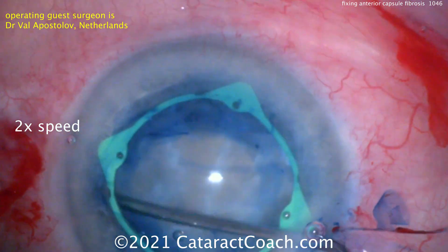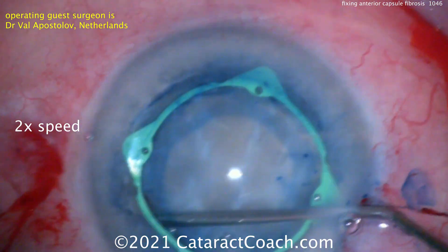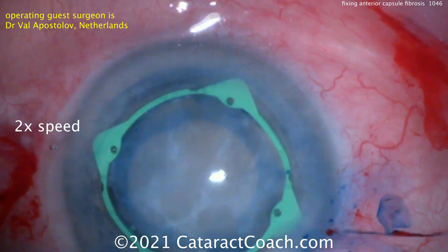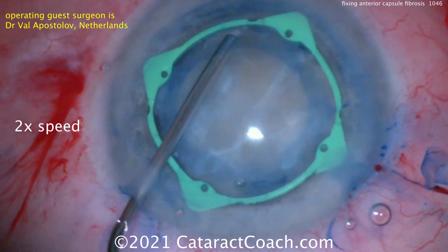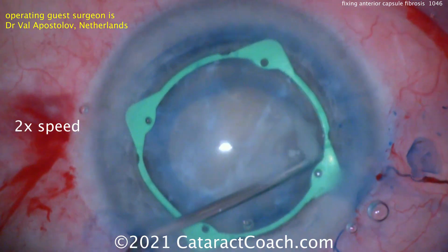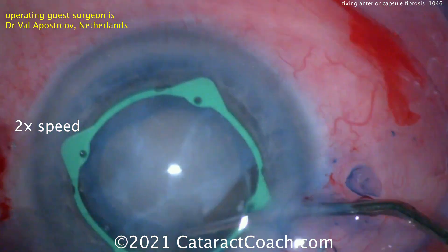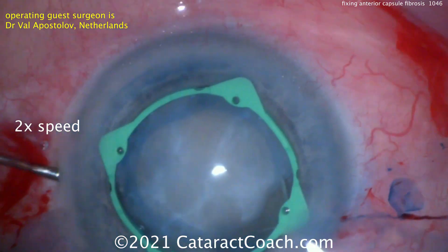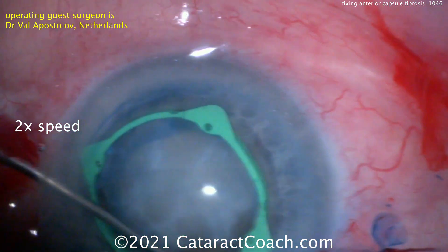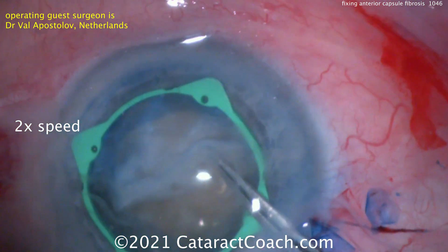A different approach to the fibrotic anterior lens capsule — I think that's pretty brilliant. Let's show the rest of the video at two times normal speed. You can see that even before starting the phaco, he's doing more separation, really getting the nucleus separated from the lens capsule so he can spin the nucleus and do his chop technique without worrying about putting tension on or damaging the capsule. He's going around to separate the undersurface of the anterior capsule from the adherence to the fibrotic anterior cortex.